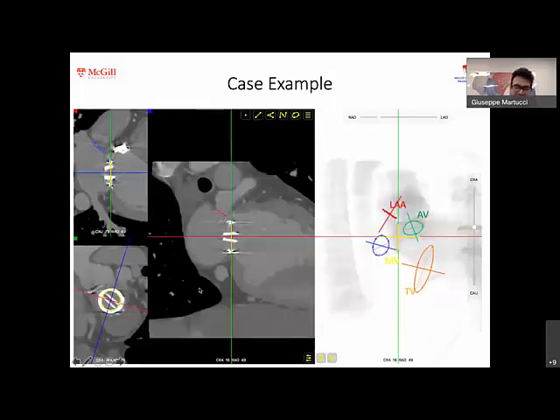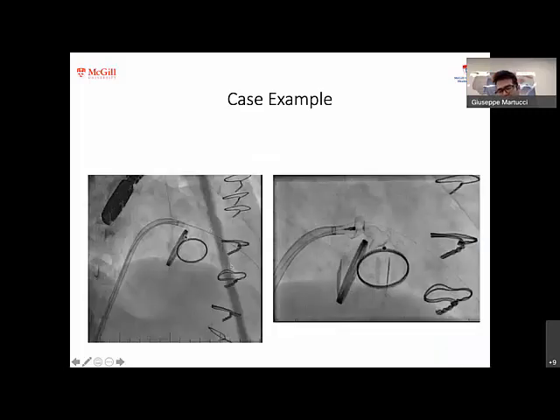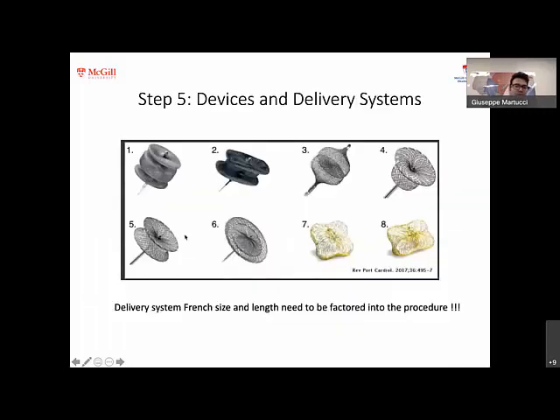We now take the same picture. We've just reoriented it. So here we go. This is your two-chamber view. Again, identical to the case that was presented. Here is your left atrial appendage, left atrium, left ventricle. Here is your valve. You can appreciate that there is contrast going across the left atrium, outside the valve, into the LV. And once you've identified this view as where your leak is, the next step is really to do exactly what was just discussed. So this is the procedure. It resembles exactly what was just discussed.